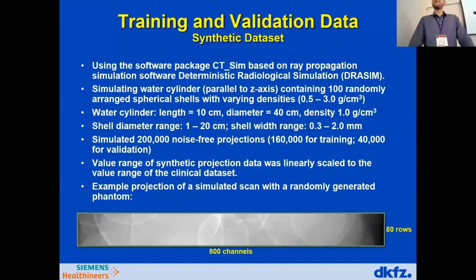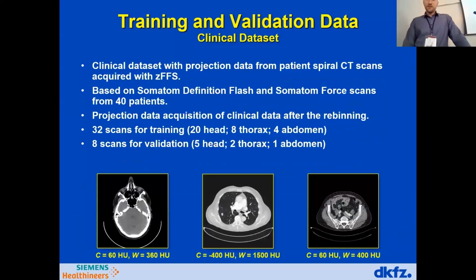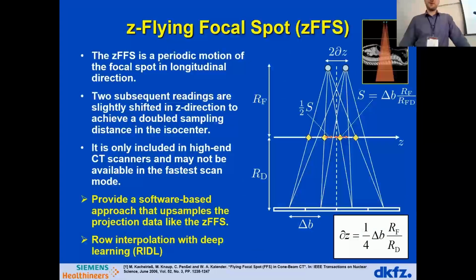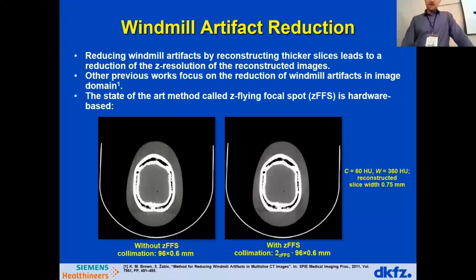You mentioned very early on in the talk that a higher frame rate could also help reduce the artifacts. What kind of frame rate are we talking about? Like reducing acquisition time, taking more images.